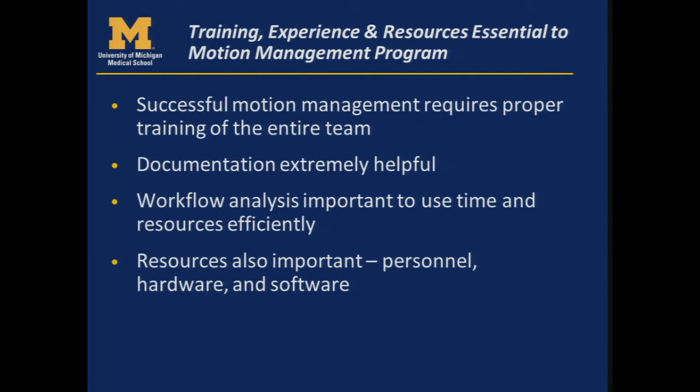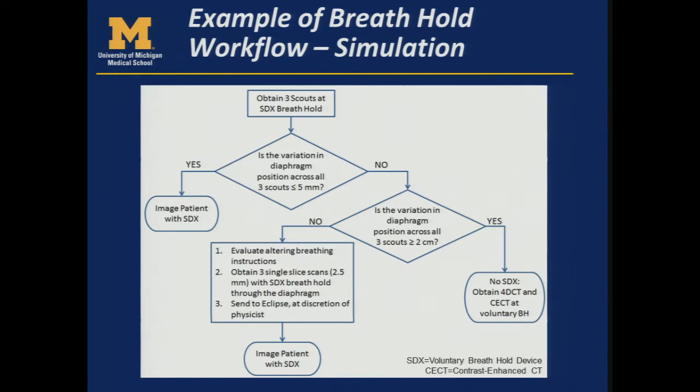One thing to mention too is training and experience and resources are really essential for a motion management program. You need proper training of the whole treatment team, documentation, and workflow analysis to make sure you're using all of your tools in an efficient way. And making sure you have the right personnel, hardware, and software to do these abdominal treatments in a safe way with motion management. And so this is just an example of our workflow for simulation.